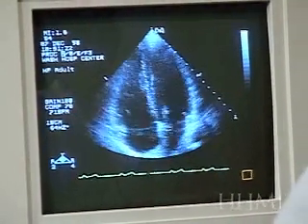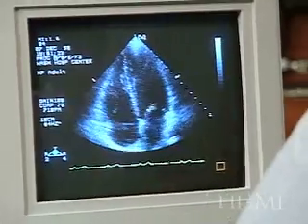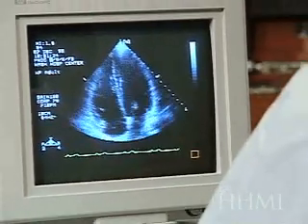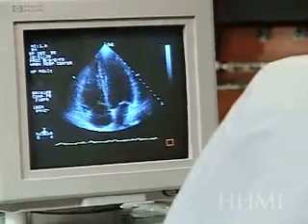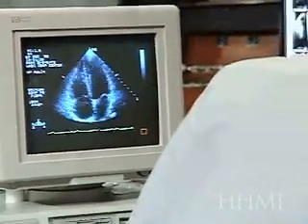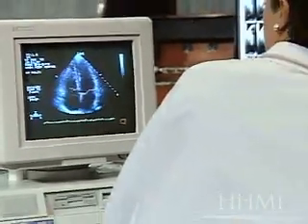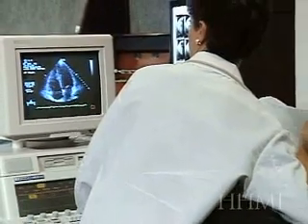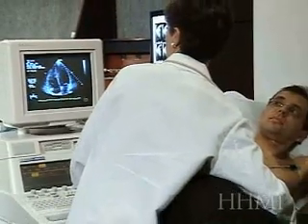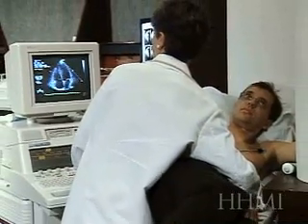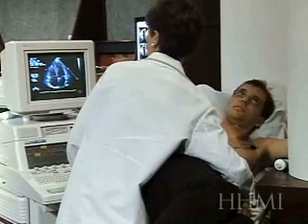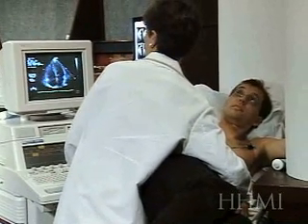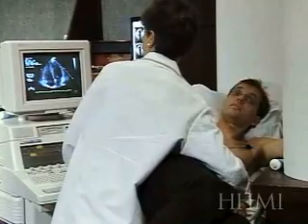Diane Batkin is a cardiologist from Australia who is a researcher in our group in Boston, and she is now going to show you an echocardiogram of Dr. Kevin Davies, in which we will see normal heart structure and function.